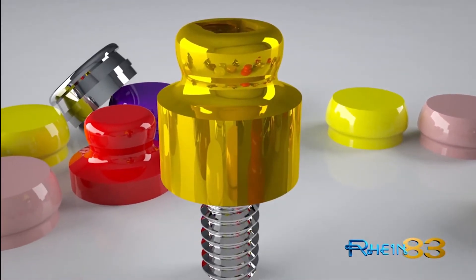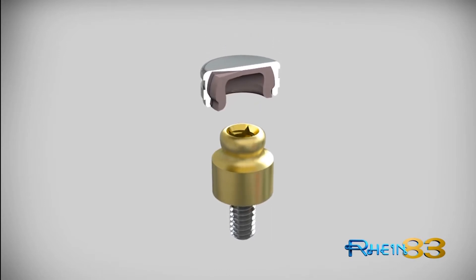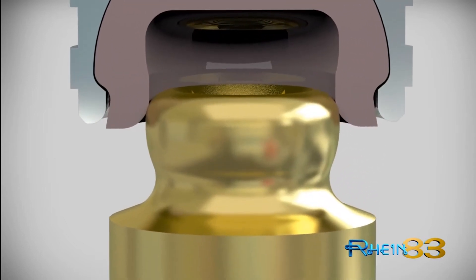OT Equator's innovative design offers the best aesthetic results. OT Equator is the smallest attachment available on the market. Even with its reduced height and width, Equator maintains equal retention values of the most popular ball and cap attachment systems.